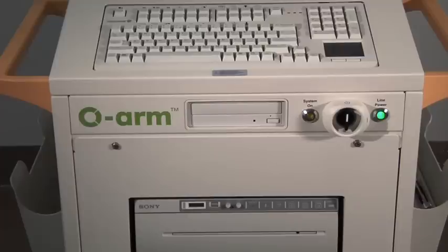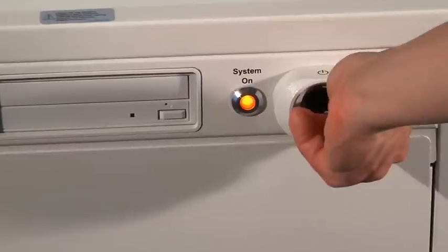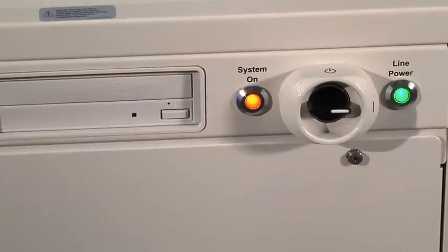With the OARM IAS on and the systems connected, you now turn on the mobile viewing station. Turn the power on switch to the right. The system on indicator lights up.